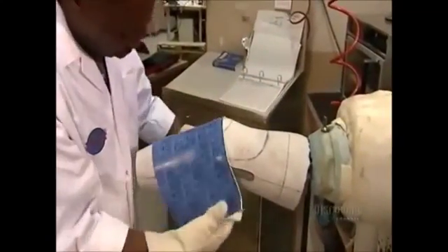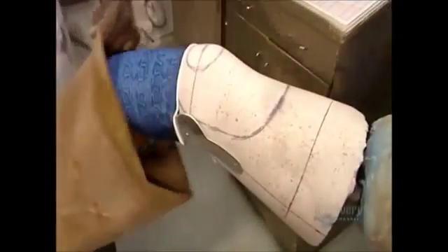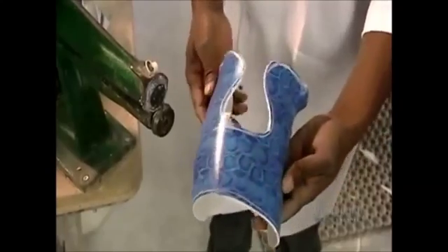They carefully position the hot decorative plastic on the model. Using a vacuum bag, they remove the air and press the plastic on tightly. The plastic sets in about 2 minutes, maintaining the form. They cut the required shape, line the inside, and sand the edges smooth.